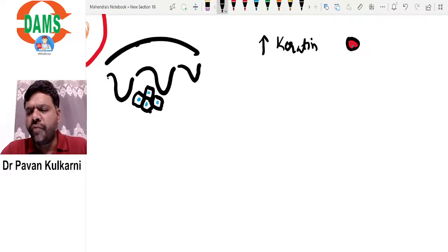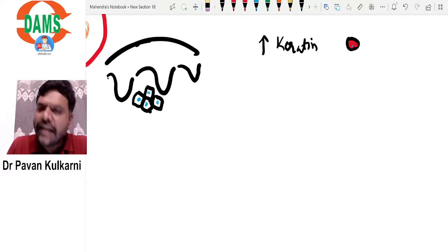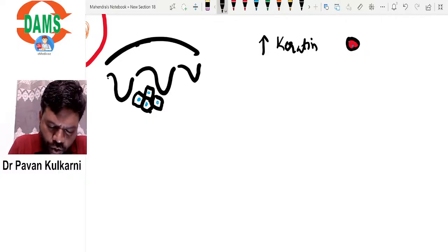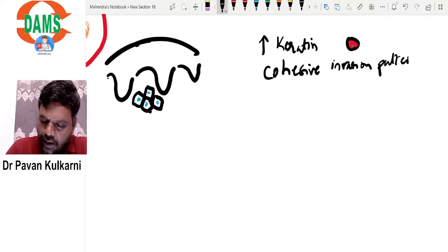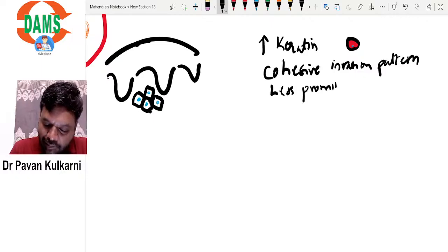There is a cohesive invasion pattern, and there will be less prominent dysplasia.